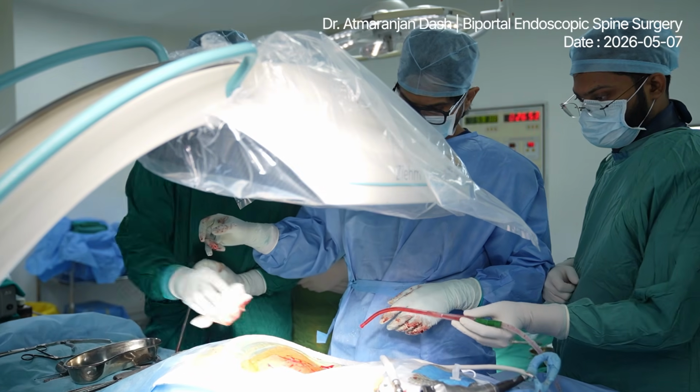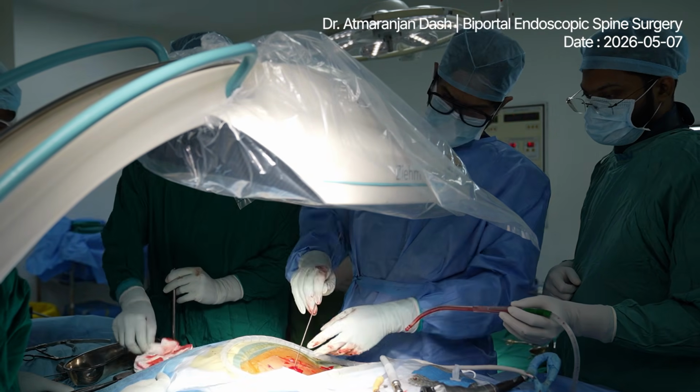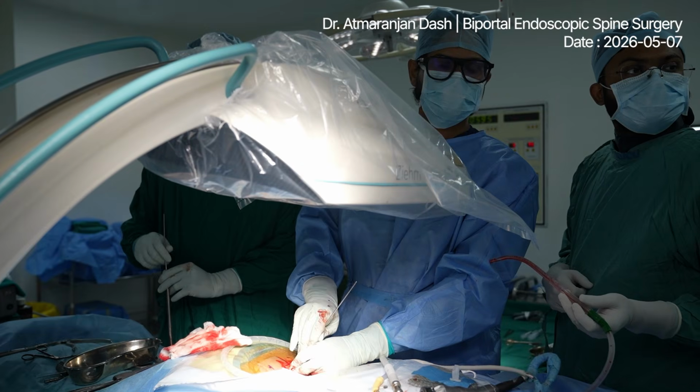Dilators. Now you see we have arrived on the foramen of this level.